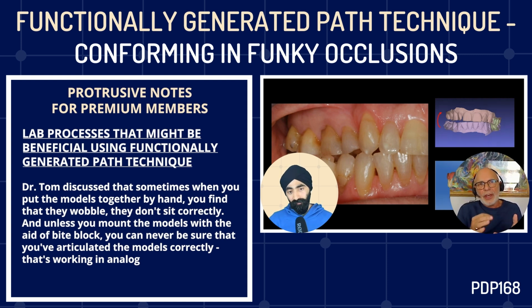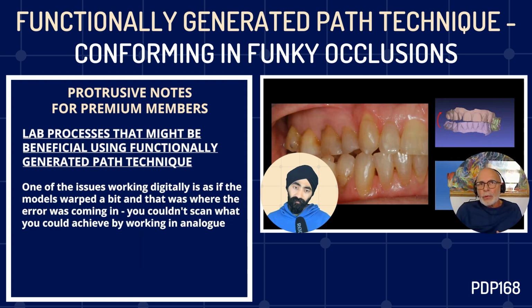And unless you get a wax bite block made and you mount the models with the aid of wax bite block, you can never be sure that you've actually articulated the models correctly. Now that's working in analog. When you're working digitally, of course, you're trying to catch the occlusion with your scanning.